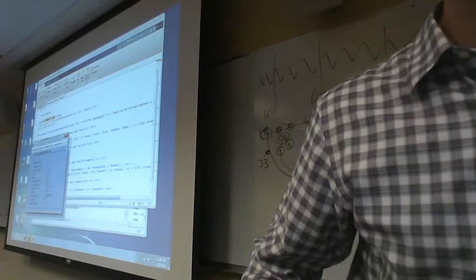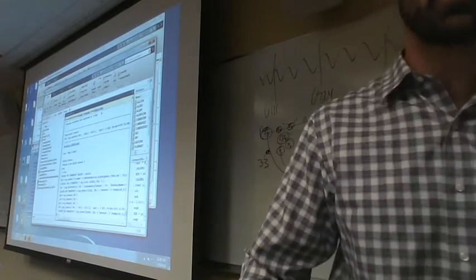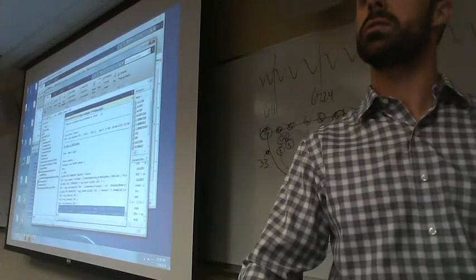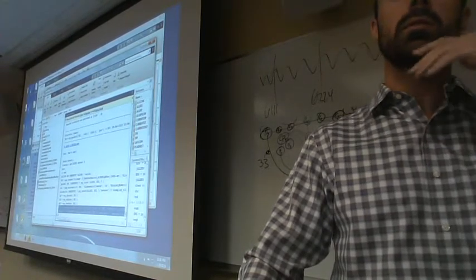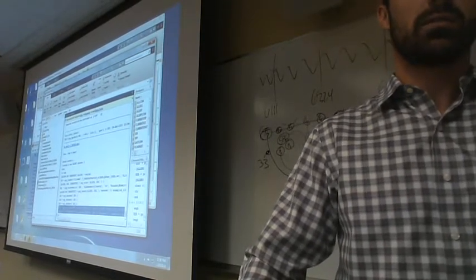And now what we can do is come back to our MATLAB window and type EEGH again, and we'll get the little output for bin epoching. We can add that to our script, which is actually your notes for what we studied today, which I recommend studying for when you come back so we know the steps that we took. What were we supposed to do in that extract bin epoch? You just go to, just run.